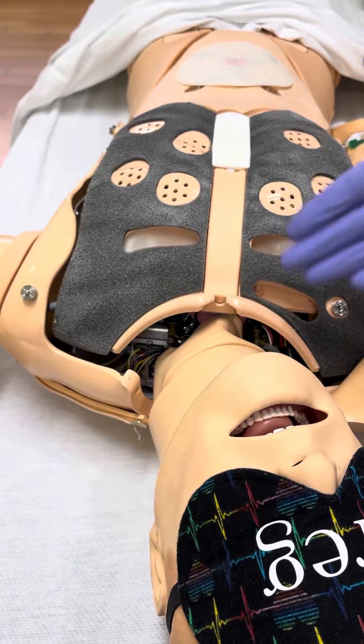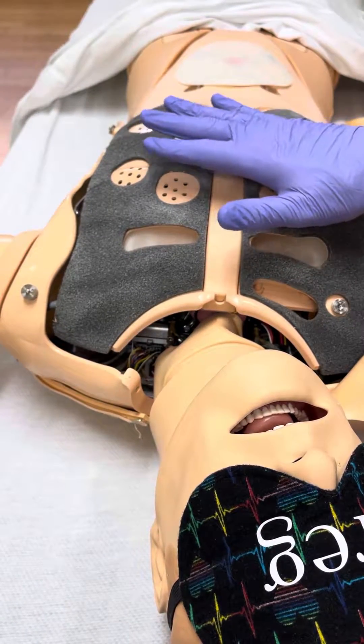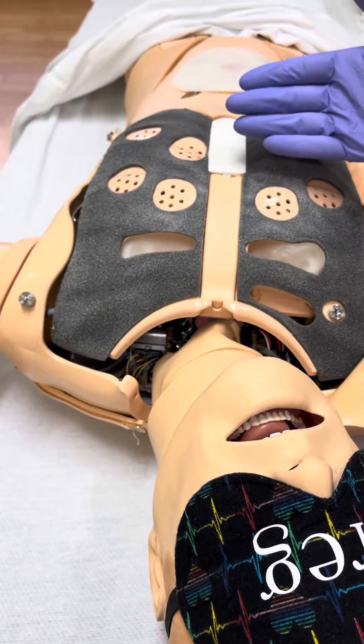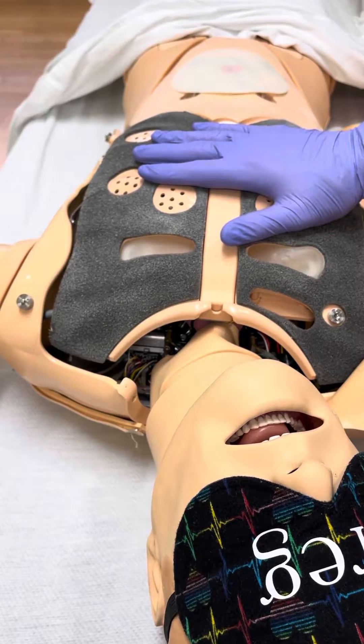Today we'll be going over how to fix the lung sounds or heart sounds on the Cynman 3G, Essentials, or Cynman ALS chest plate.